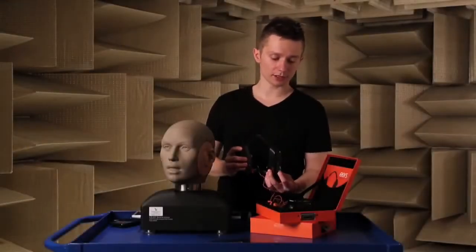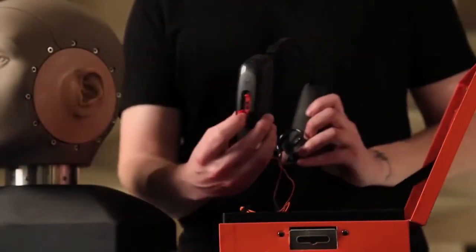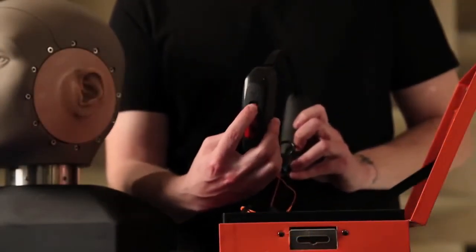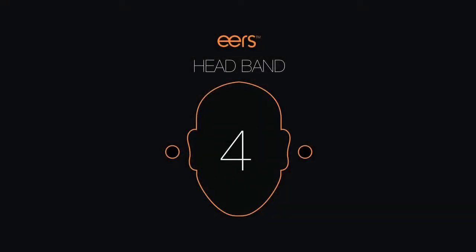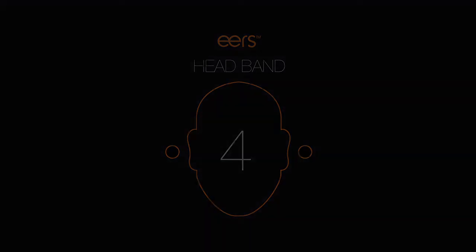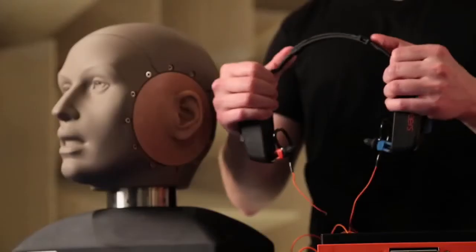The next step is to unlock each side by sliding your finger into the groove and upward until you hear the click. Next, slide the adjustable band wide.